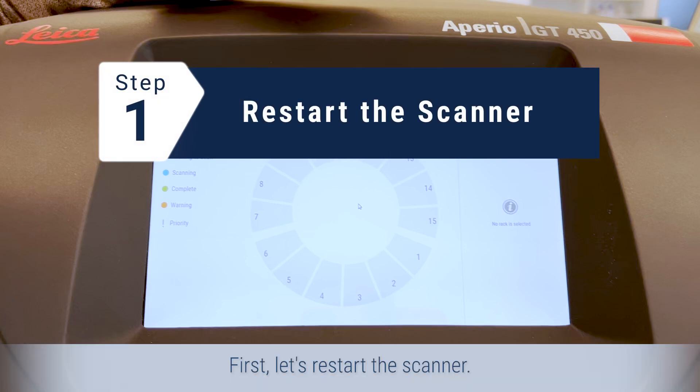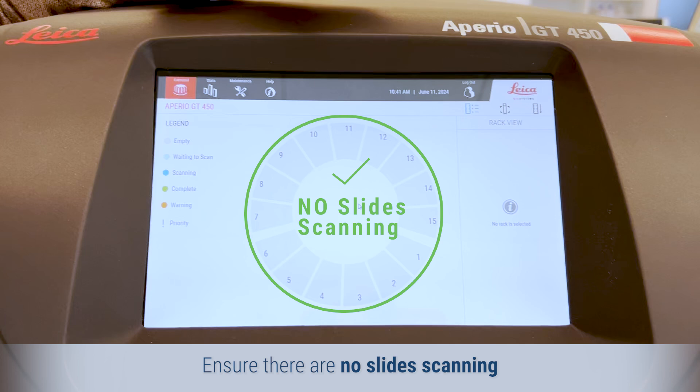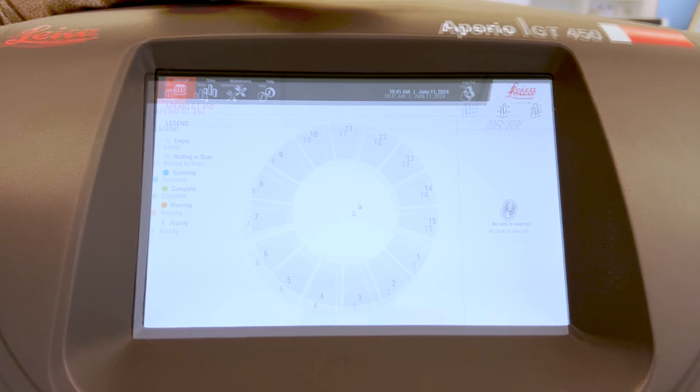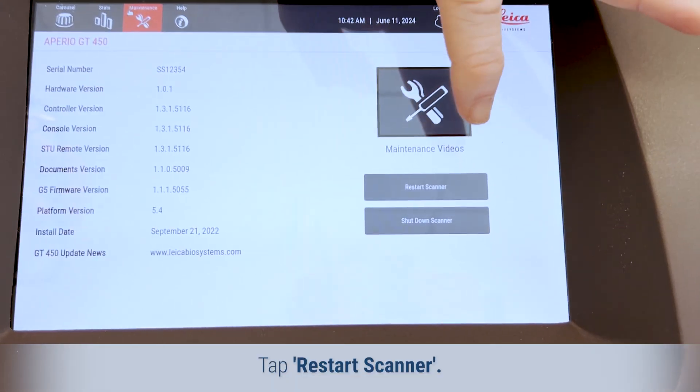First, let's restart the scanner. Ensure there are no slides scanning and no errors displayed on the touchscreen interface. Tap Maintenance, then tap Restart Scanner.